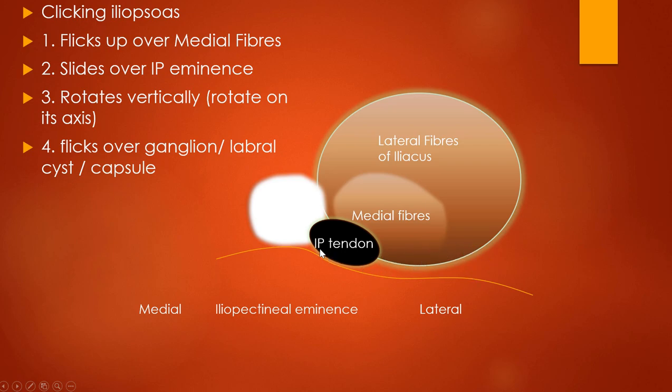The bursa is located deep to the tendon, so if we're guiding injections, we can guide through the muscular window of iliacus, a fairly safe, straightforward path to the bursa. So we don't want to see the tendon lifting up off the bone, as that can be an indicator of bursitis.